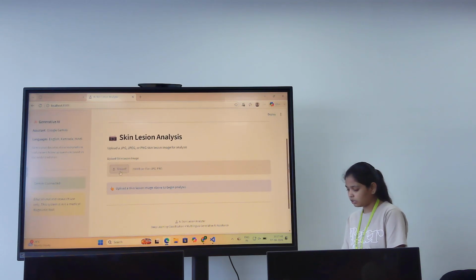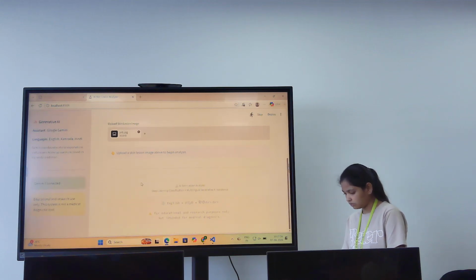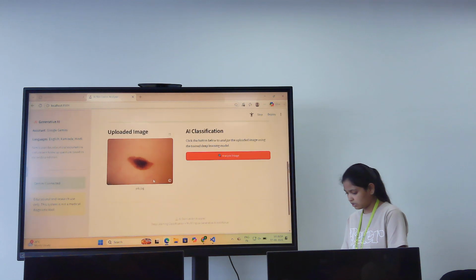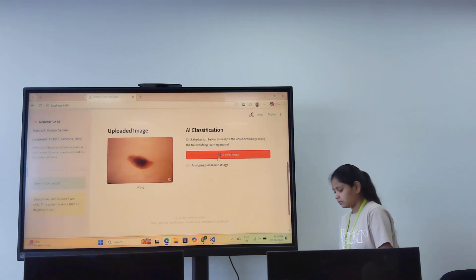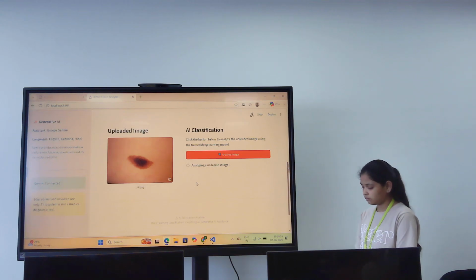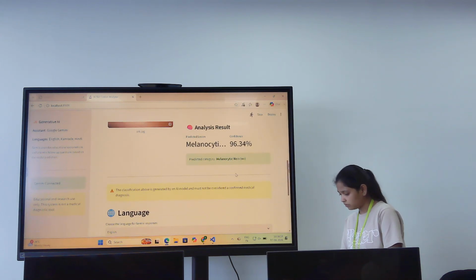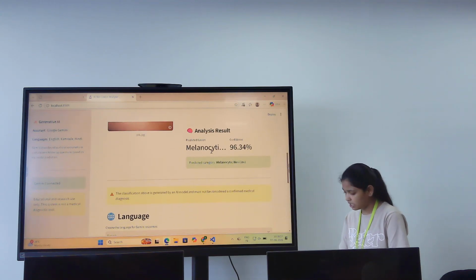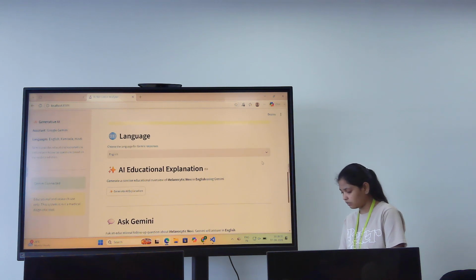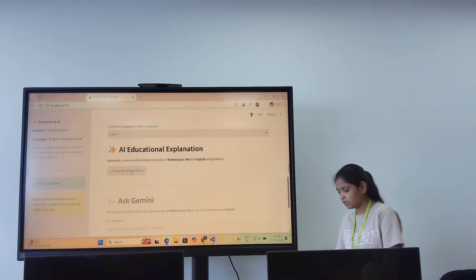Here we can upload the image. I upload an image. The system analyzes the image and gives the information about the disease and the confidence score. Here we see the disease name and the confidence. Here we can switch the language. First I show English. This gives the generative AI explanation.